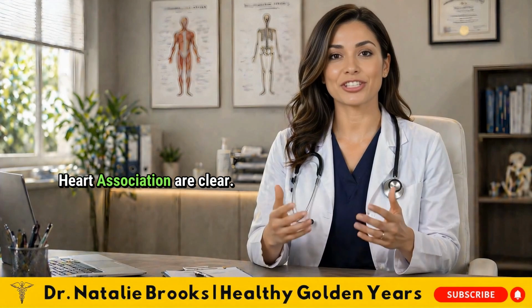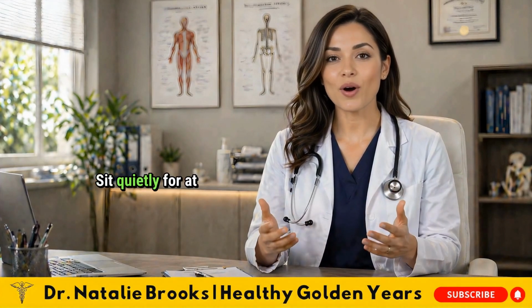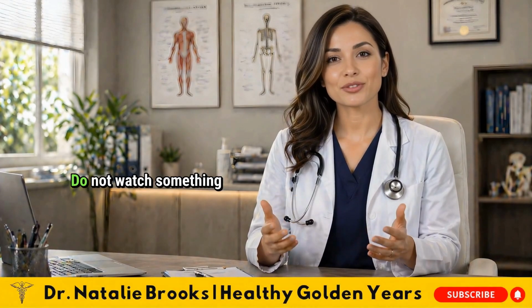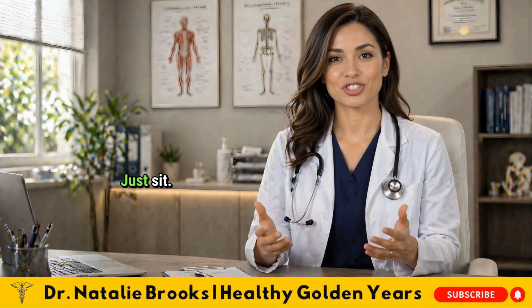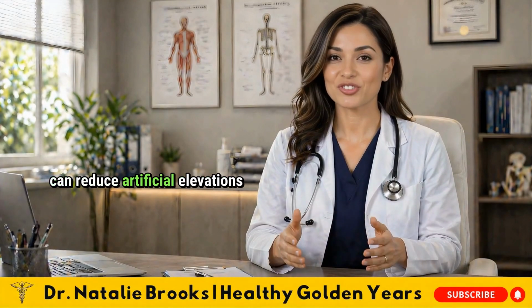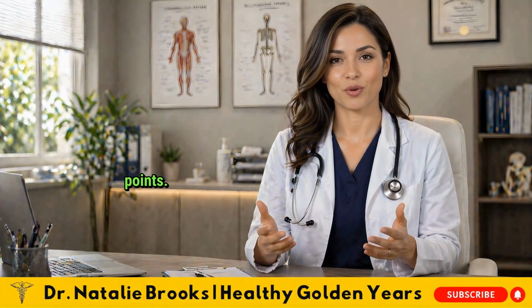Guidelines from the American Heart Association are clear. Sit quietly for at least 5 minutes before taking a reading. Do not talk. Do not watch something stressful. Just sit. This single habit change can reduce artificial elevations by 5 to 15 points.